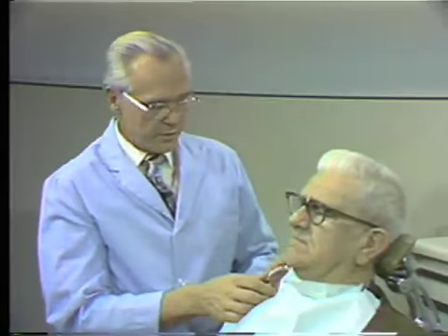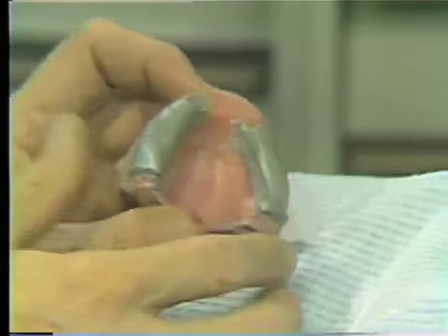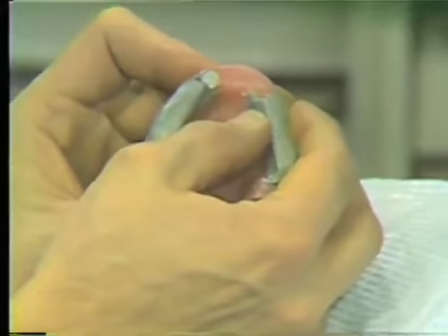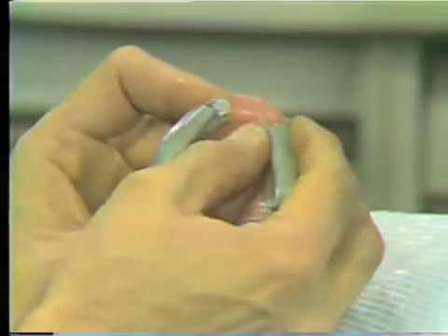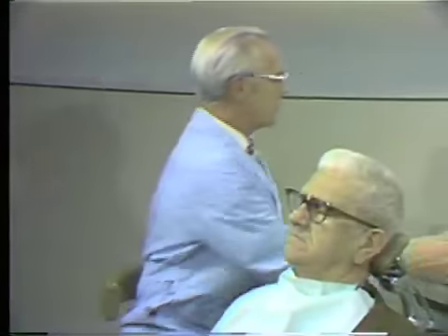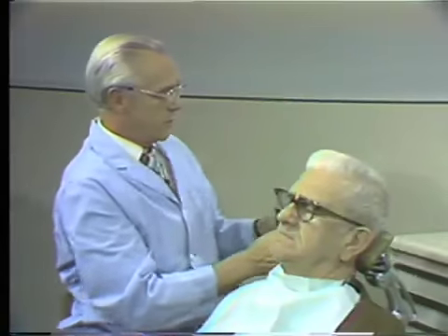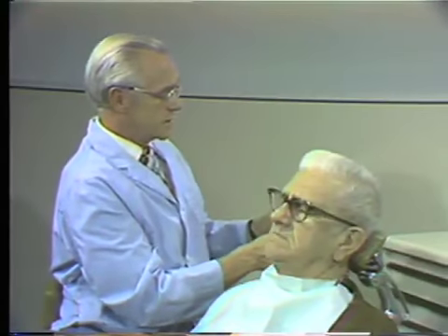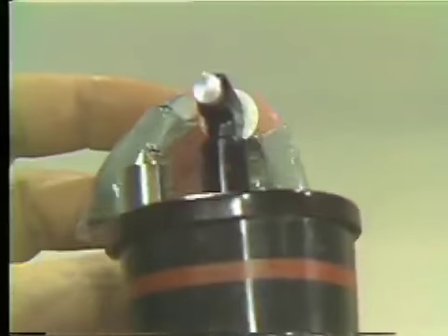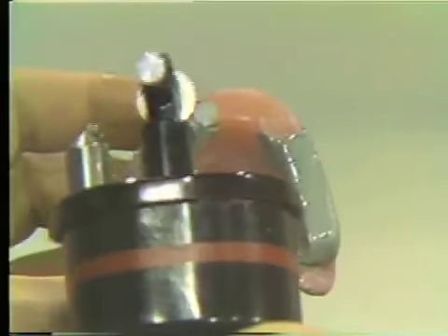We're now going to verify the centric relation. As you can see, I have added extra new soft wax to the maxillary rim. We will now soften this uniformly using the alcohol torch, and we will flame this soft wax both sides equally. You can see it flows at a very low temperature.